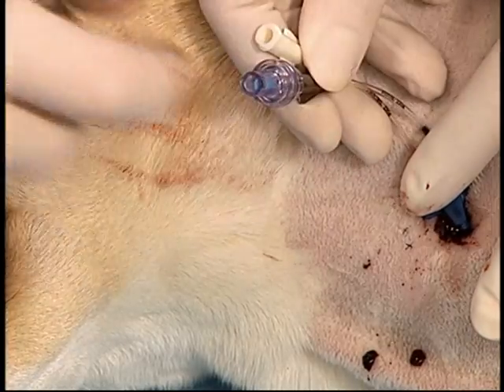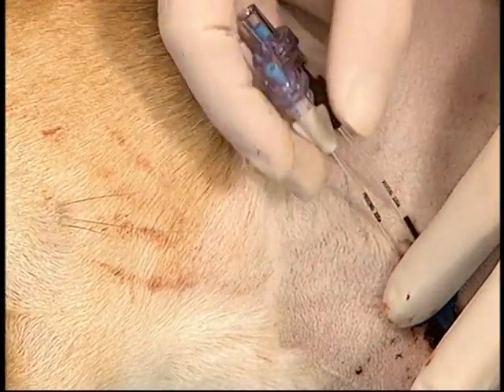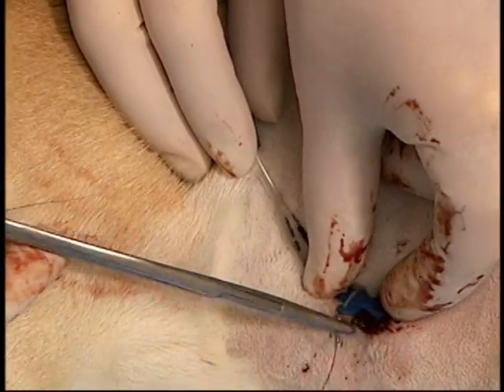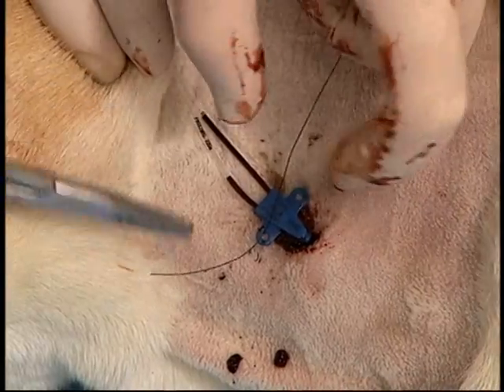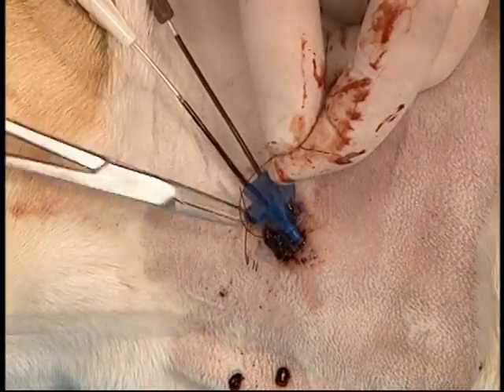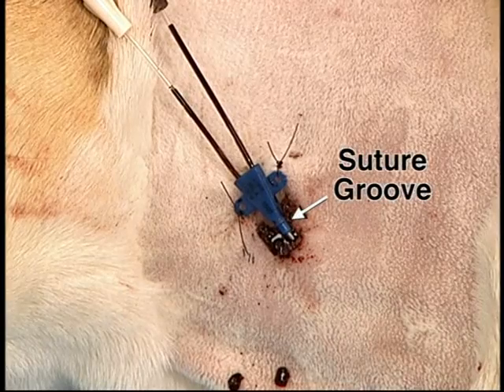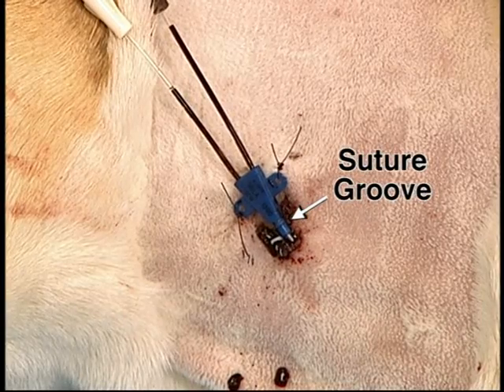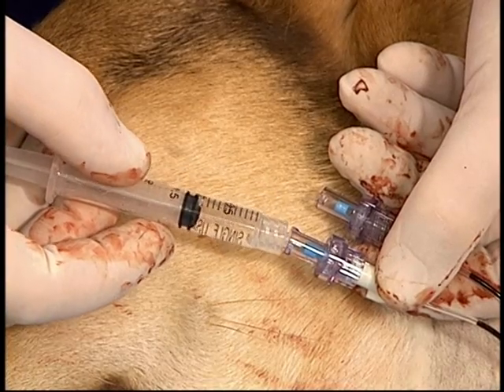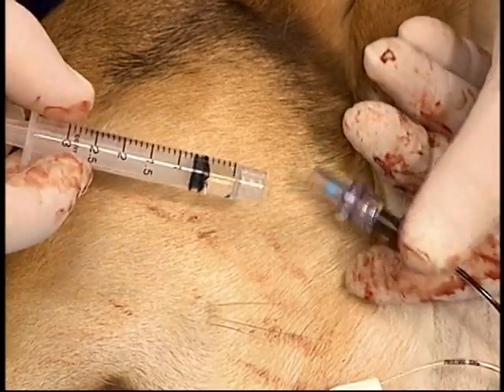A needleless injection cap is then inserted over the top of each hub to prevent blood leakage from the catheter, and then the catheter is sutured in place. For additional security, a third suture can be placed around the distal suture groove and through the skin. Each lumen should then be flushed. The advantage of these needleless injection caps is that fluid cannot come in or out of the catheter until the central valve is depressed. Blood should be aspirated to ensure appropriate location of the catheter, and then the catheter should be bandaged.